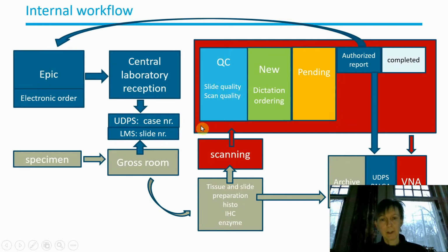And after a quality check that I will demonstrate on the next slide, the case will be released for the pathologist to look at, and then depending on whether more stains or additional, for example, molecular tests are required, the case will be in the system until the report is authorized.